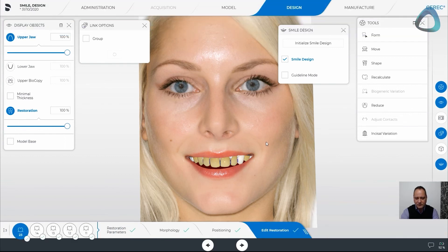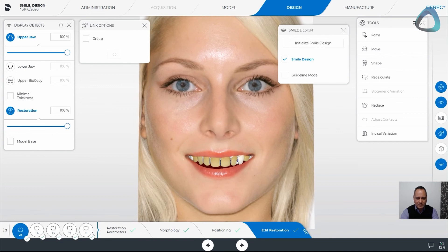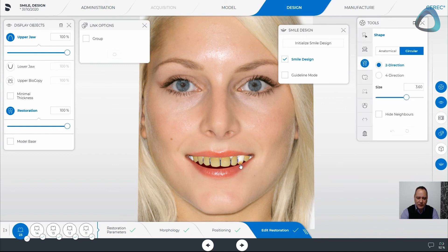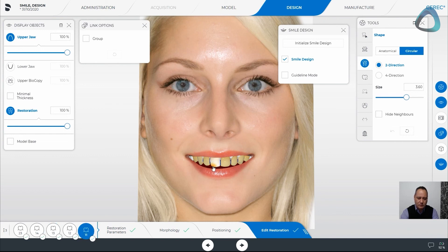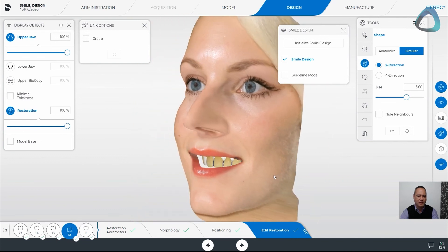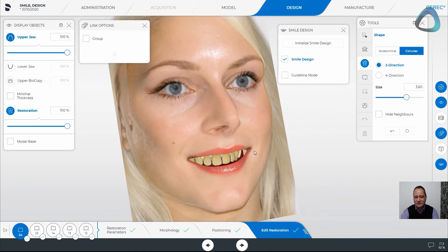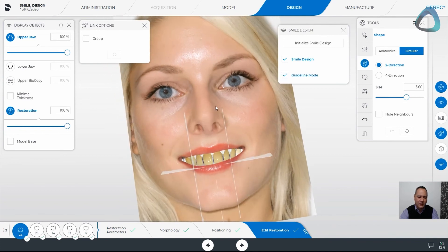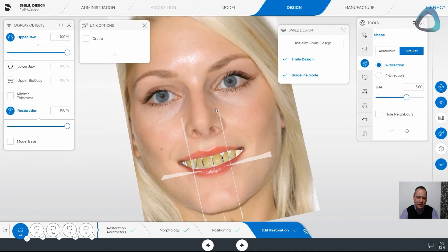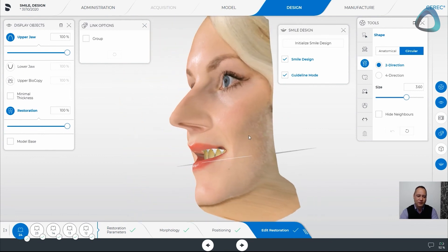The design on the mock-up is finished, so we can see this canine sits a lot further down — do I want that canine to come down as much? Within that design I have the ability to push these back up, perhaps lengthen this one slightly to compensate, and bring the smile back into play to line them up. So extending these slightly, we're now lining up into the smile with our three-dimensional image. That is smile design. We can put our guidelines back to check our midlines and planes and use it for reference.